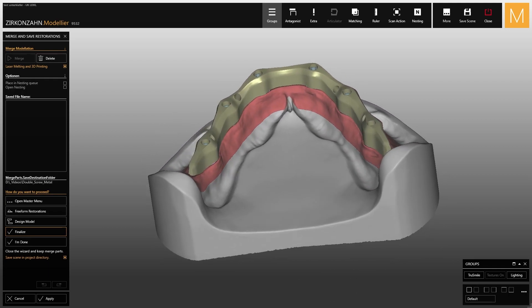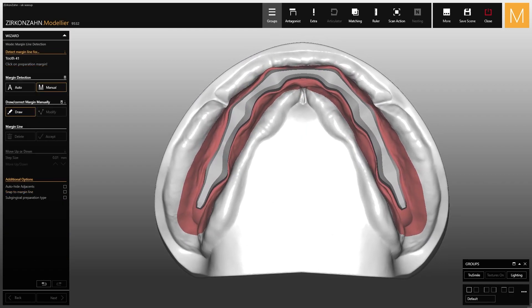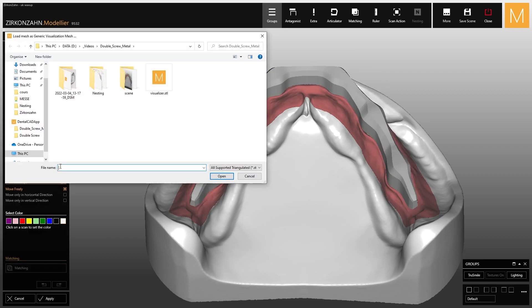Now, go on with the realization of the secondary structure. Open the wax-up project in order to adapt the created setup to the bar. Before proceeding, go to the master menu and open the function for adding and removing scans, and load the saved visualizers from the previous project as generic view.